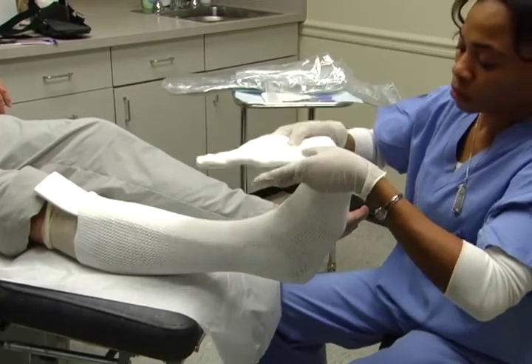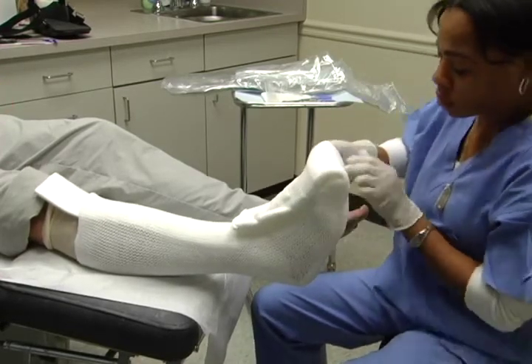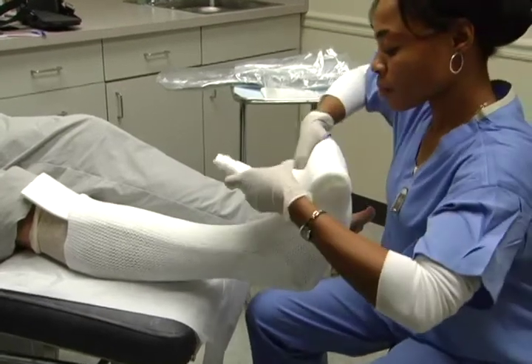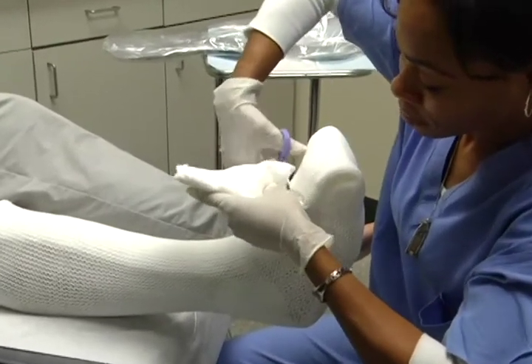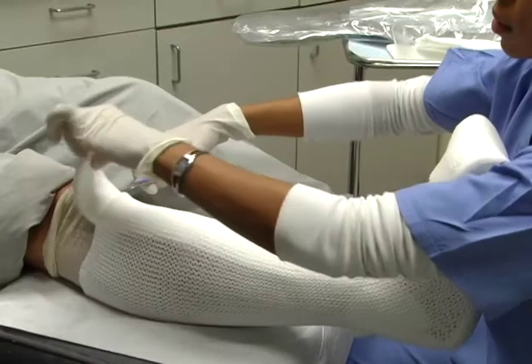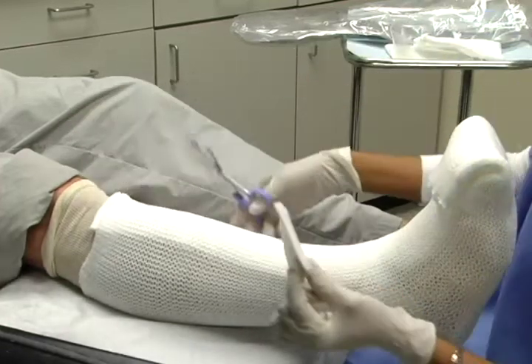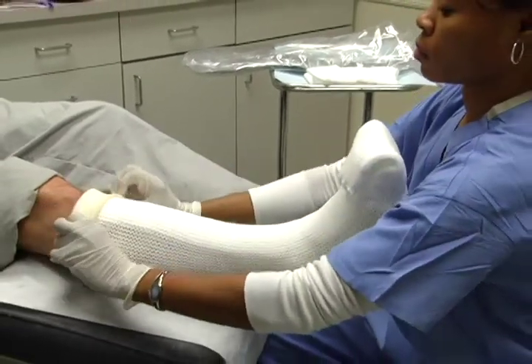Pull the sleeve to cover the toes and fold the excess sleeve over the dorsum of the foot. Secure with plastic tape and trim the excess. Step 5. Proximal cast edge. Cut the excess felt padding at the knee, even with the thick white sleeve, and fold the proximal end of the tan stockinette back to complete a finished edge.